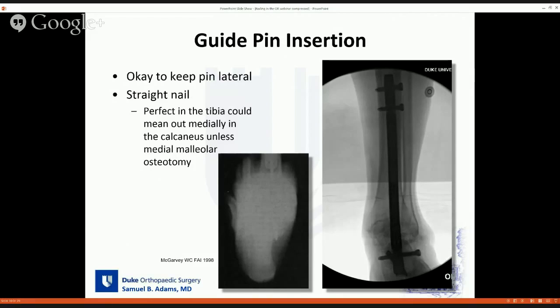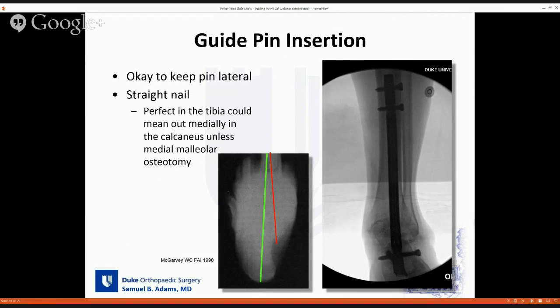Some pearls for guide pin insertion: it's okay to keep this pin laterally. Some purists say it should go straight down the tibial shaft through the center of the talus, but this is hard to do especially with a straight nail. One cadaver study showed that a centrally placed pin exits out the sustentaculum tali — obviously not where you want your nail — whereas hugging the lateral aspect of the tibia can still get you in good position in the calcaneus. One of my cases shows the nail hugging the lateral tibia, still in reasonable position in the talus and good position in the calcaneus.